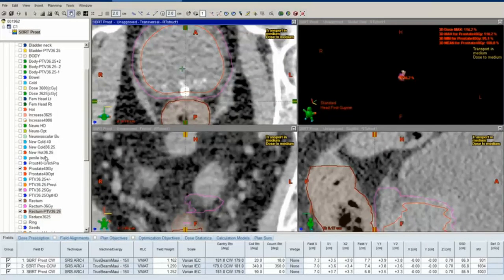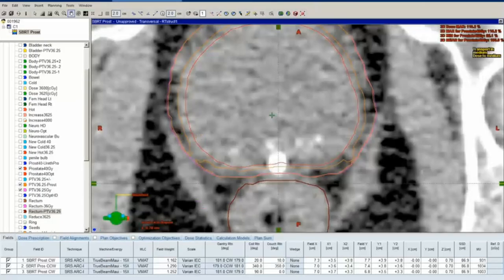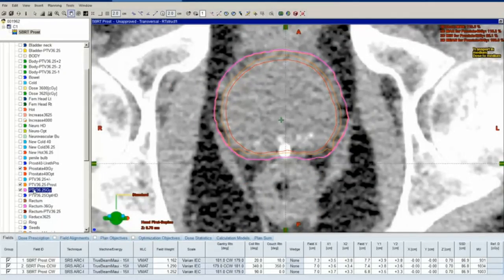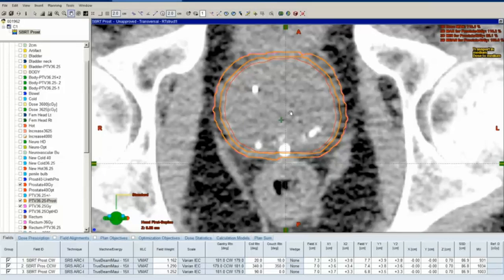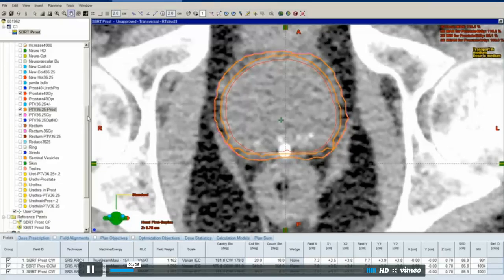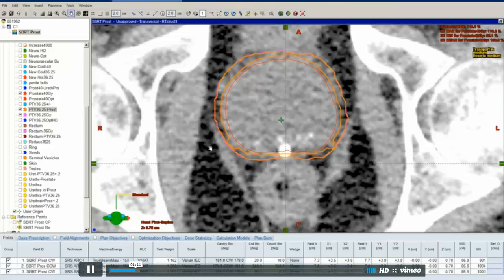I decided to create optimization PTV36.25. My main thing was these hot and cold structures, which I created after my first optimization, after my first calculation.